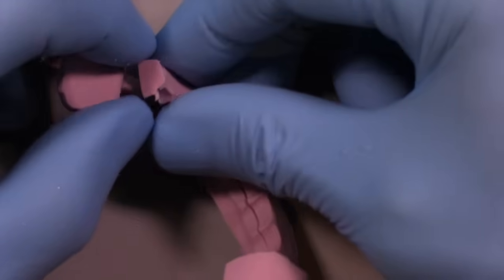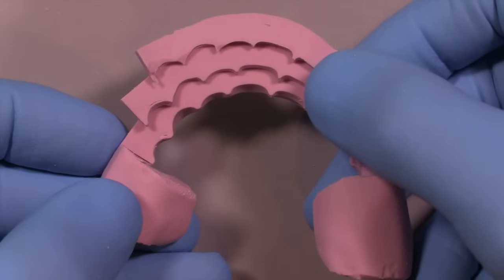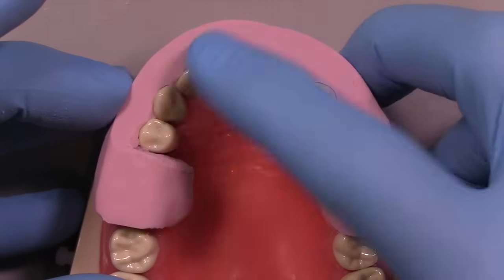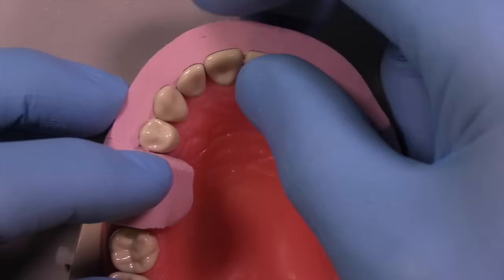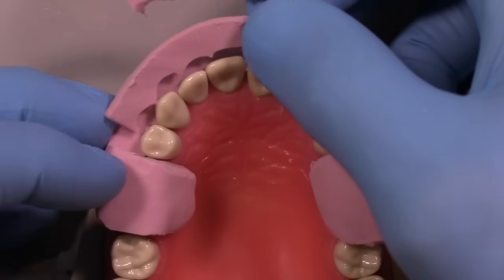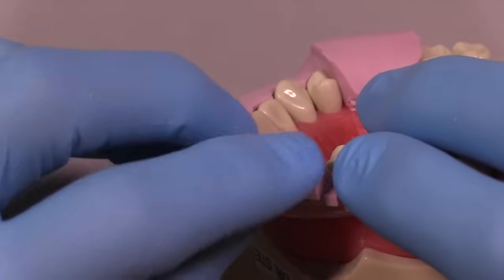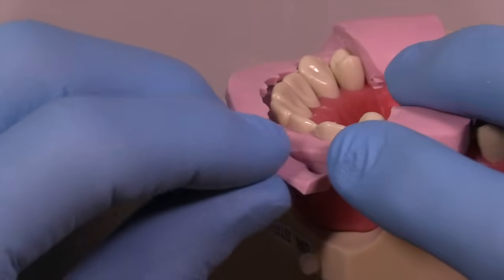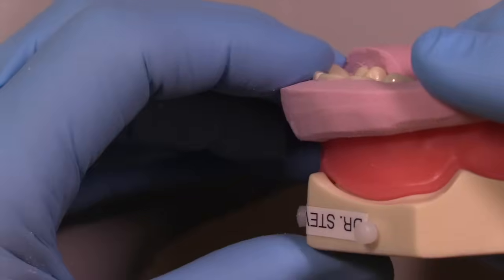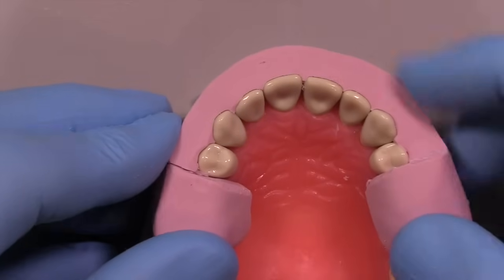We're creating this dynamic prep guide that allows us to determine adequate reduction not only in the incisal third of the facial but also the middle third and gingival third, by peeling back the leaves when necessary. The whole prep guide can be handled quite easily at this point — you can separate the leaves from each other and see how they provide depth-cut indicators at various steps of the preparation. You now have all the leaves assembled: one for facial reduction from the incisal third, one from the middle third, and one from the gingival third. Don't make the stent too thin because the leaves can break off, and don't yank them too far away or they can separate from the unreleased side.